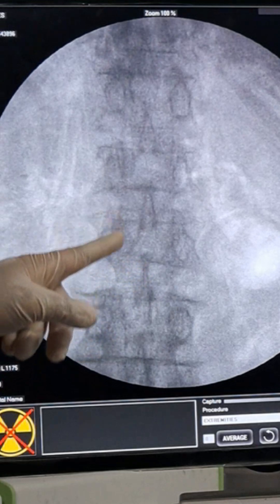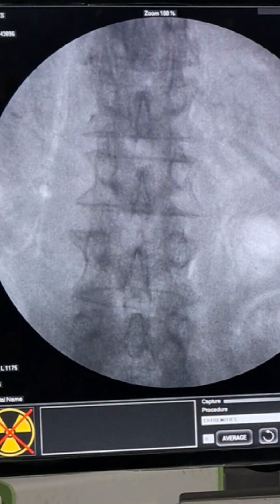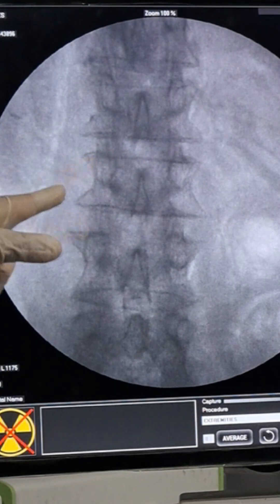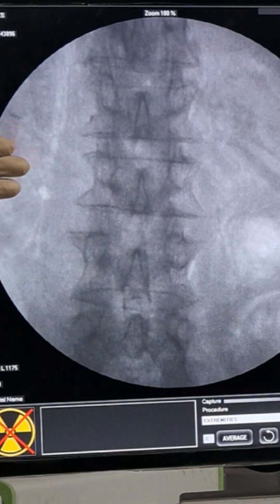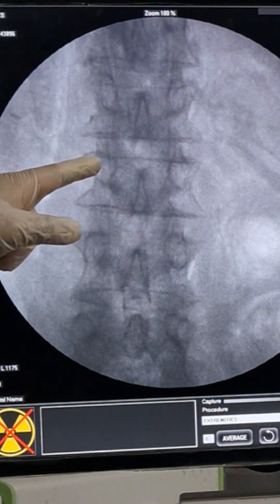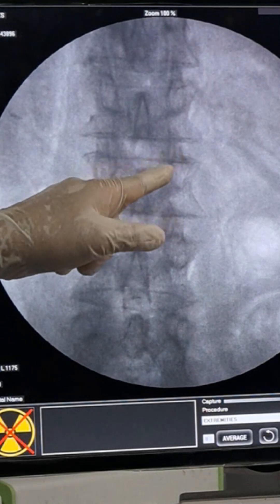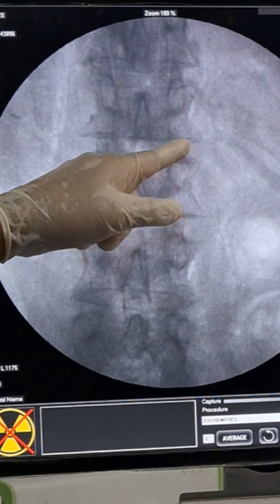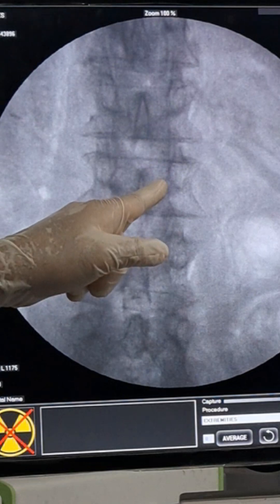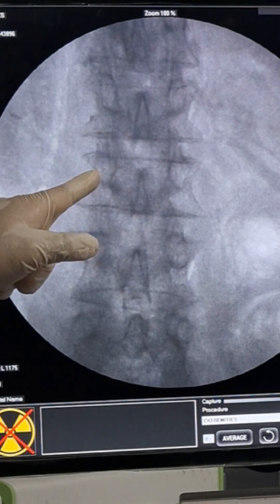It is almost true AP view; I will do squaring first. Squaring is done. Many times you may not see the transverse process properly because it is a thin plate and the picture doesn't come clearly — you can reduce the kV to see it better. If you still cannot see it, try to identify the pedicle. The pedicle will guide you to assess the transverse process, the facet, and the lamina.